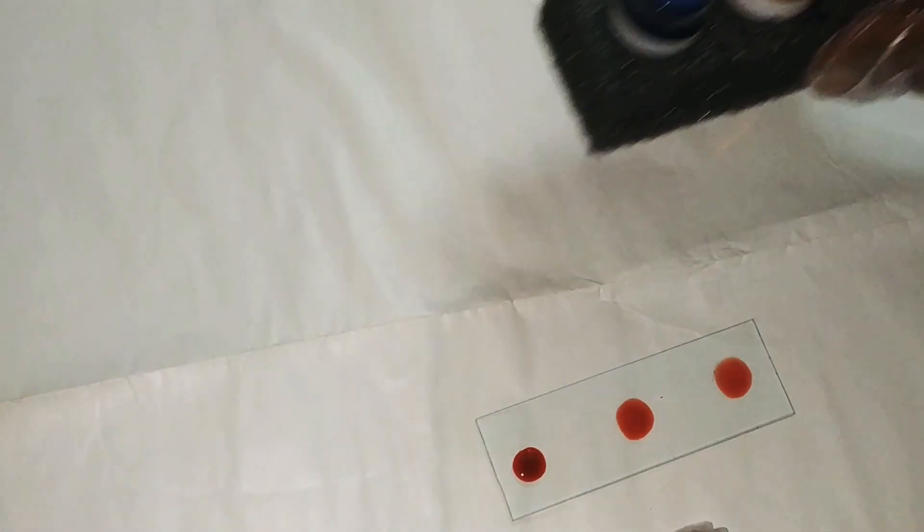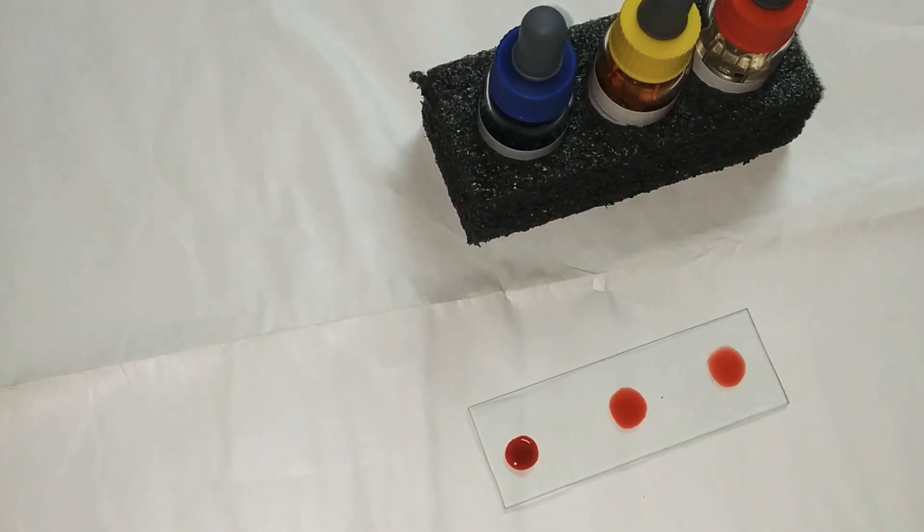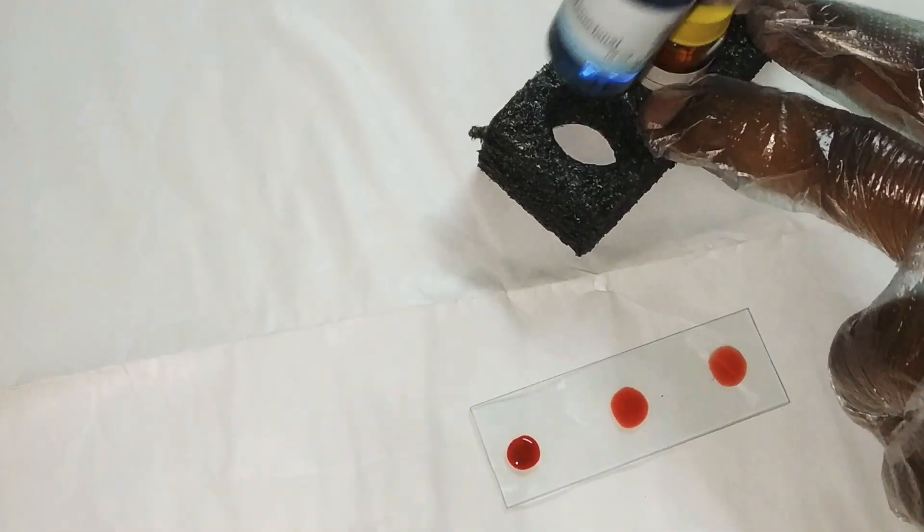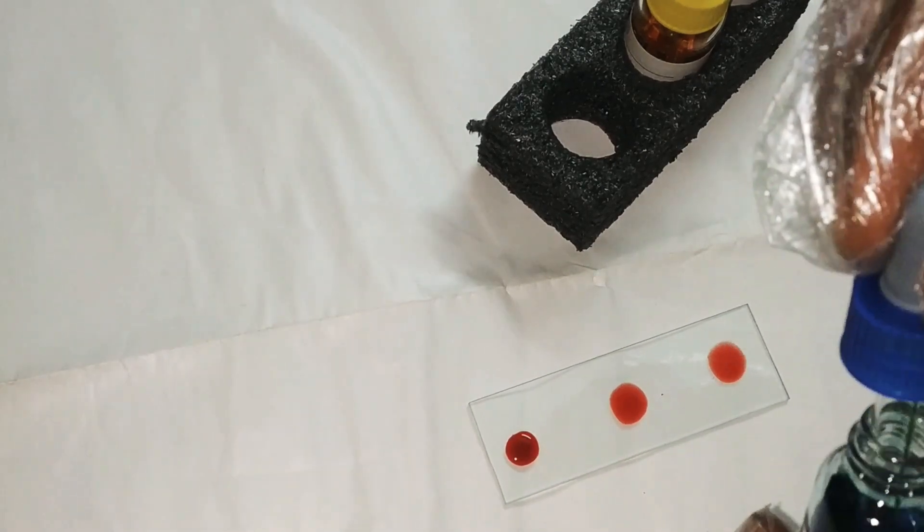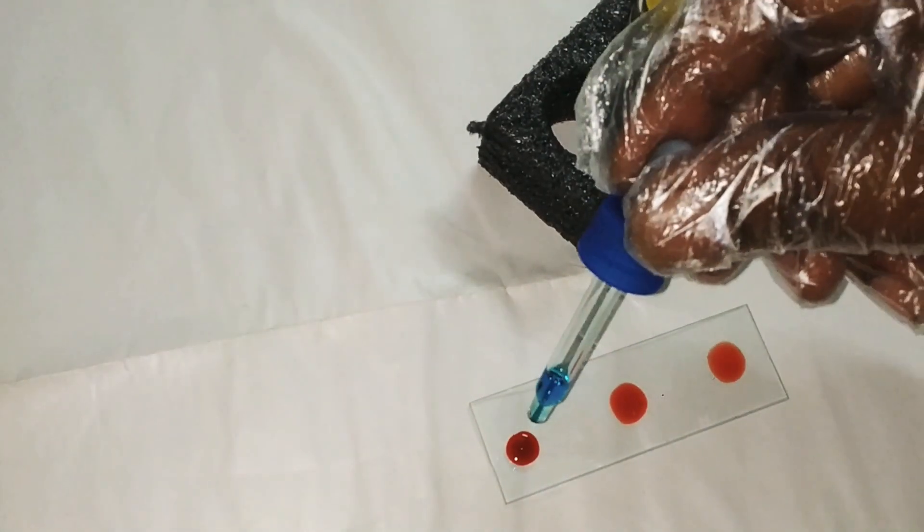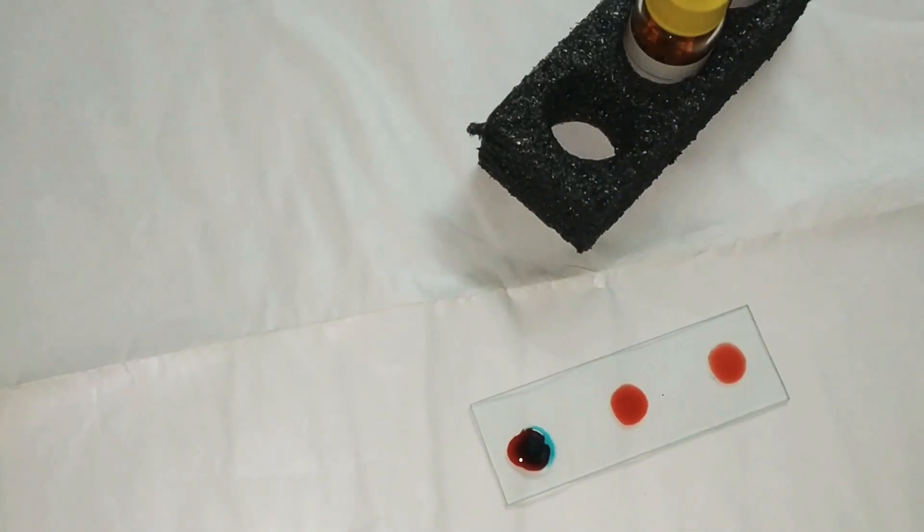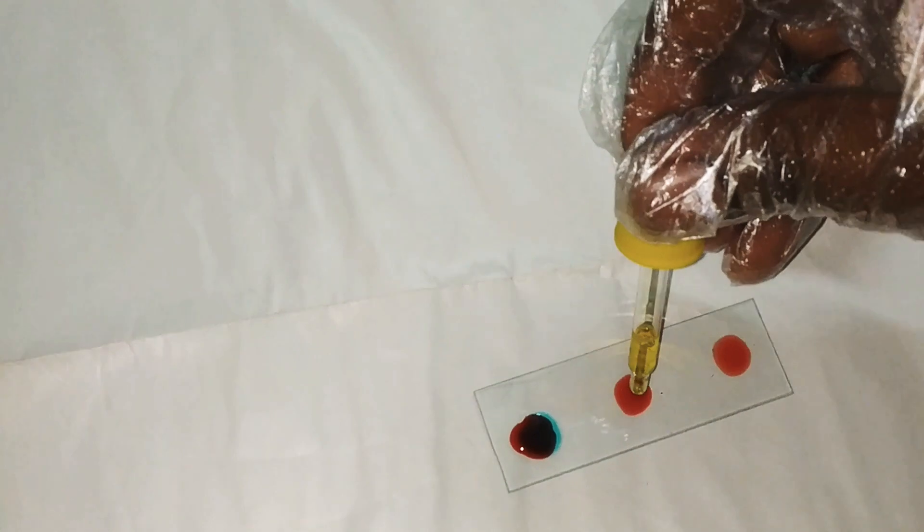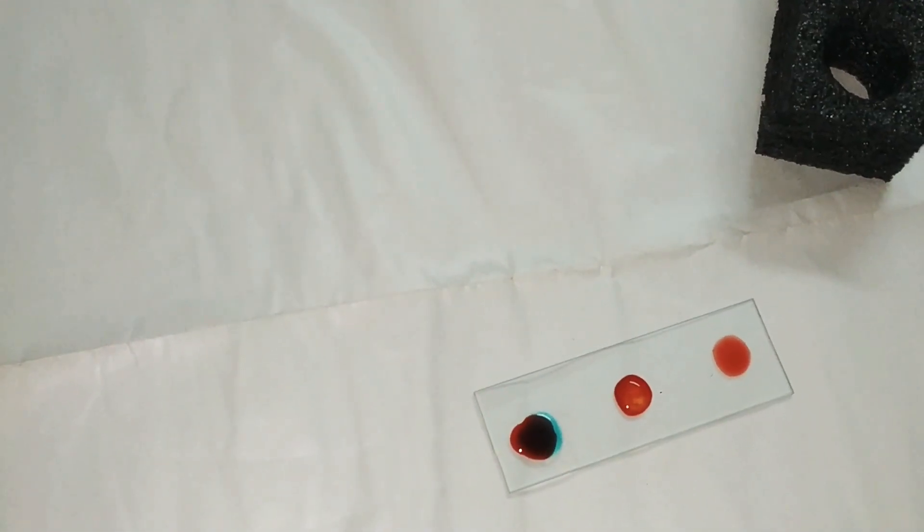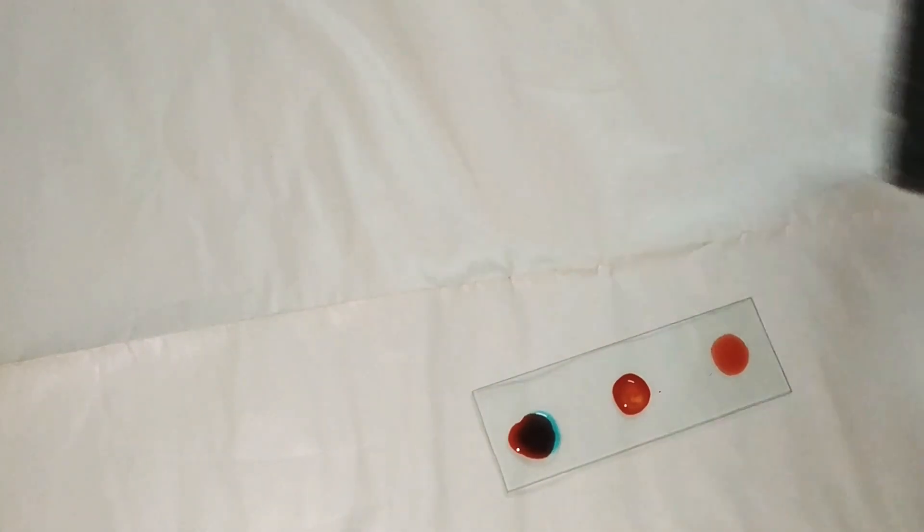So now we have collected the three drops of blood and here is our anti-serum which is at room temperature. Now let's take the anti-serum A. I'm taking anti-serum A, see here this is anti-serum A. We are putting it in the first drop. In the second, we are taking anti-serum B and I'm putting this in the center, one drop.